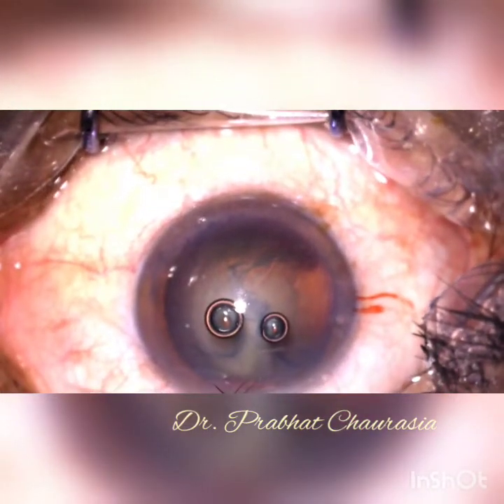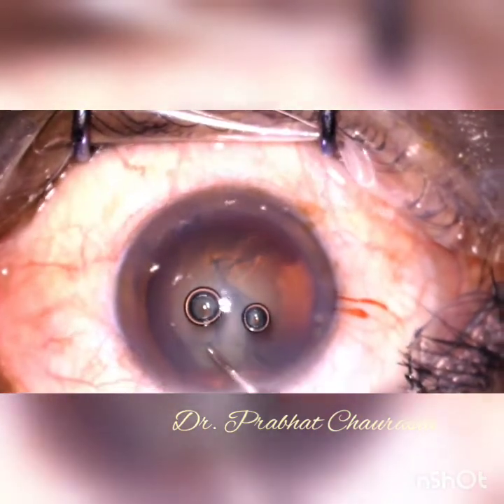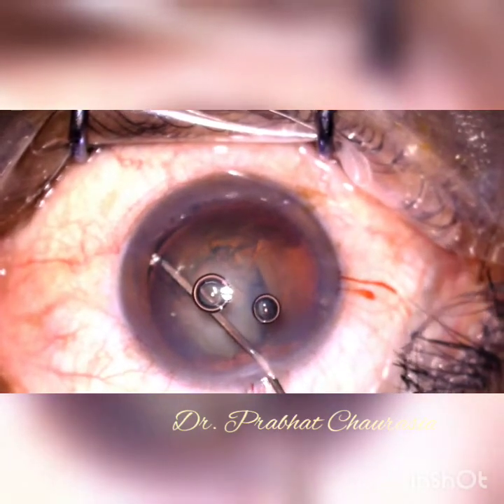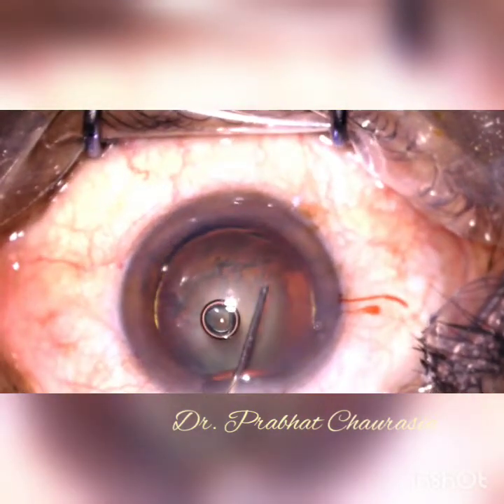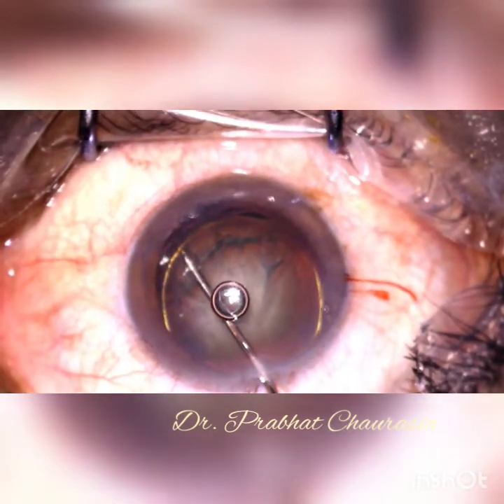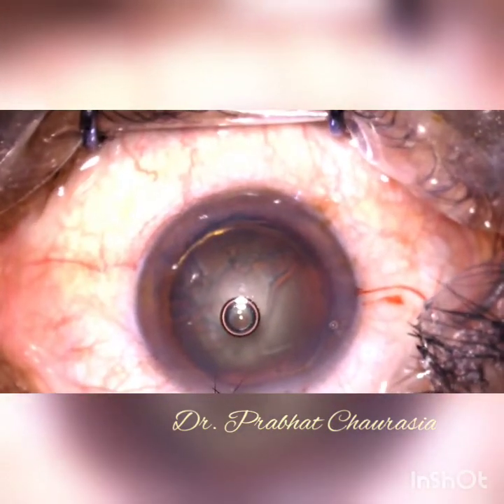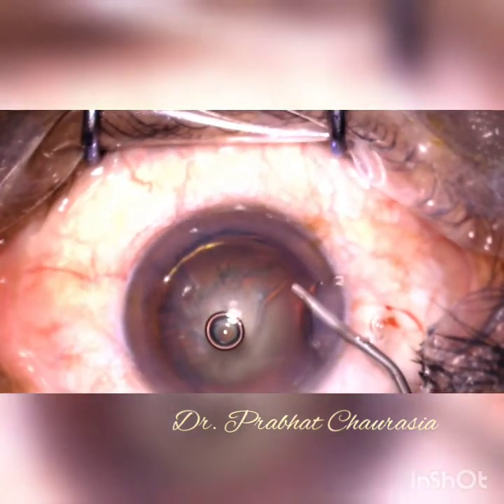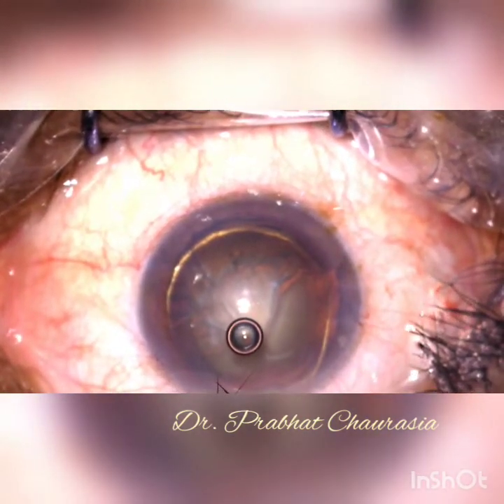This is the main port. After making the main port, I am doing the hydro procedures — first hydrodissection and then hydrodelineation. In very hard cataract, do not try for the delineation. Make hydrodissection at multiple points of the rhexis margin.